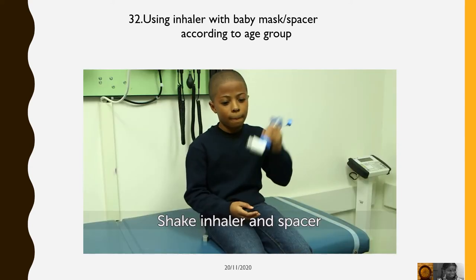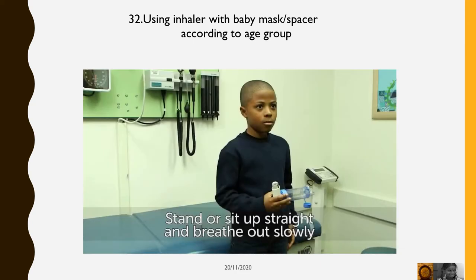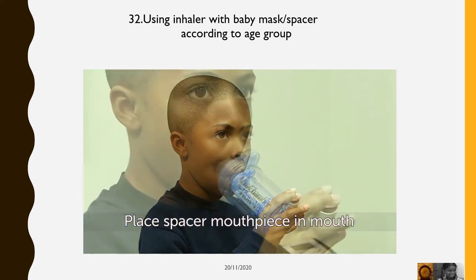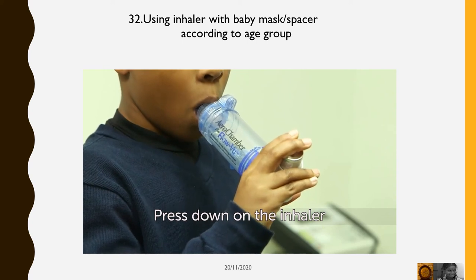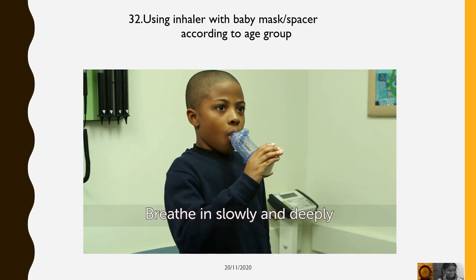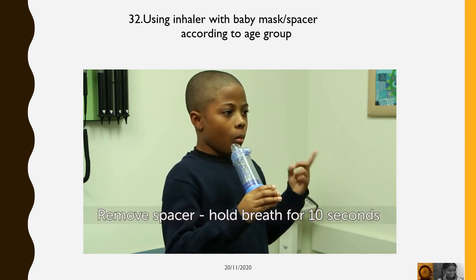Shake the inhaler and spacer to mix up the medicine. To use the inhaler, stand up or sit up straight and breathe out slowly. Place the spacer mouthpiece in your mouth and form a tight seal around the mouthpiece with your lips. Press down on the inhaler to put one puff of medicine in the chamber. Breathe in slowly and deeply, then remove the spacer from your mouth and hold your breath for 10 seconds.